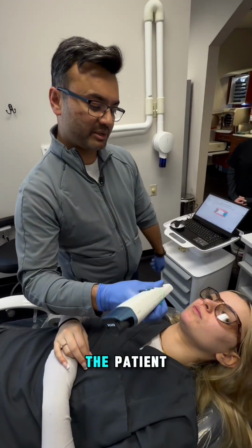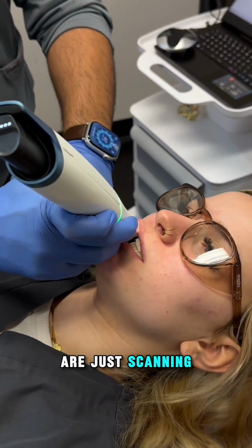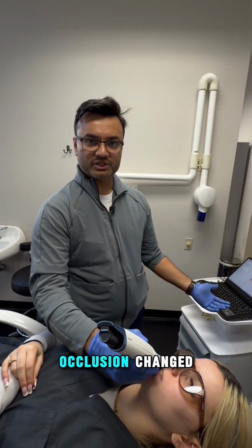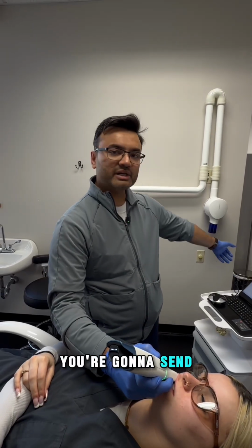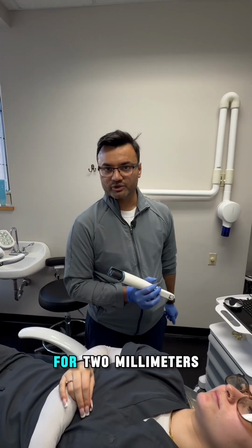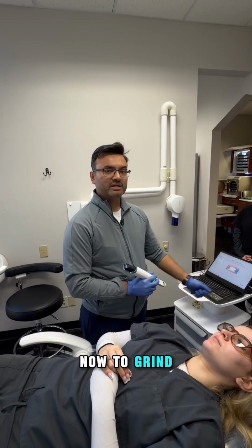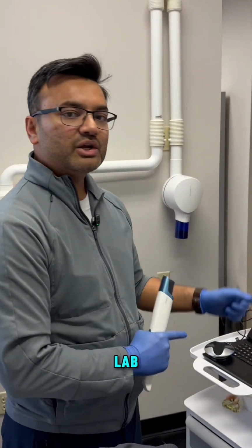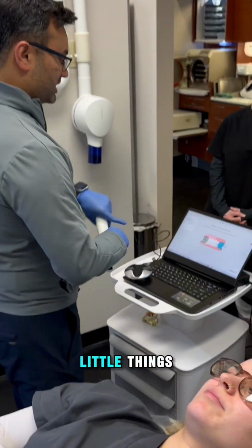But if you are just telling the patient open wide, close, and you are just scanning, you have no idea whether the mandible moved, you have no idea where the occlusion changed, because again, you're going to scan the patient in that movement, you're going to send it to the lab. Now the crown is 2 millimeters high, and then you're grinding that crown for 2 millimeters. You spend 20-30 minutes chair side now to grind that crown, because again, you gave incorrect occlusion to the lab. You did not even know that the occlusion was incorrect. So it's the little things.